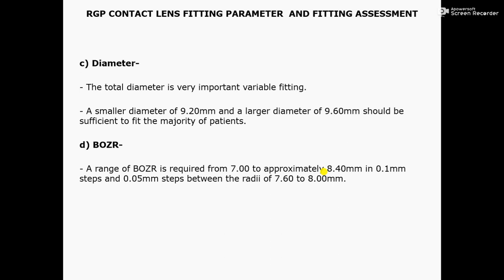It needs to be this flat with a back optic zone radius this size in order to be flatter than alignment with the cornea.